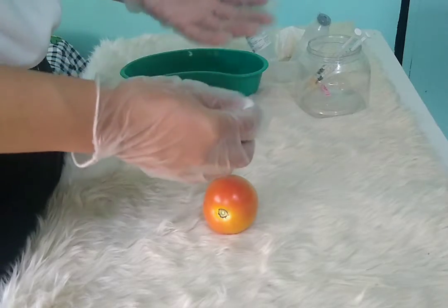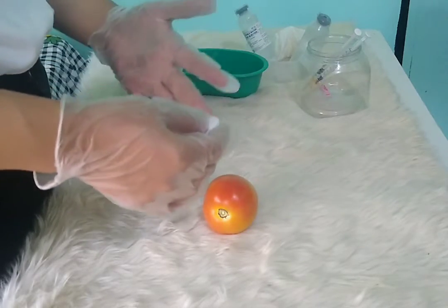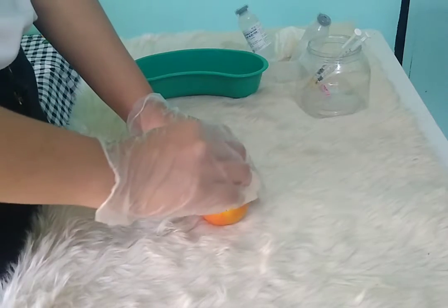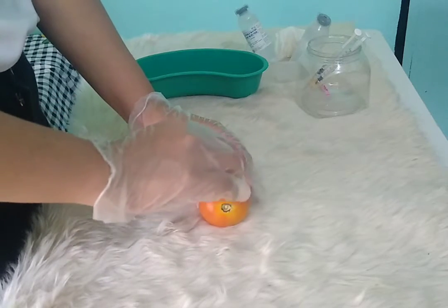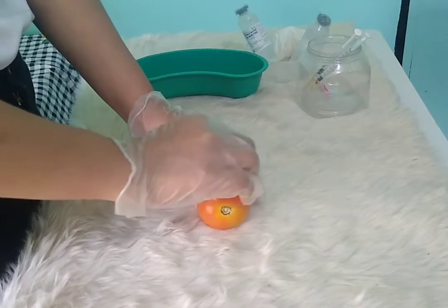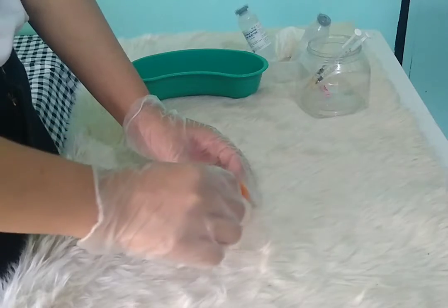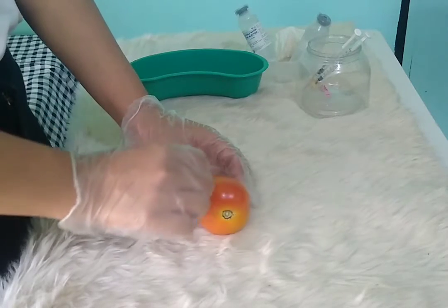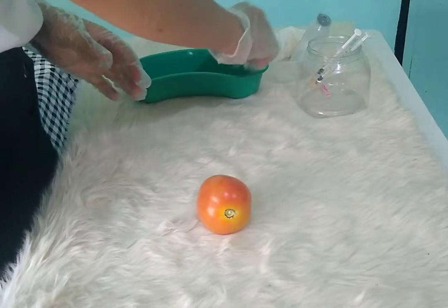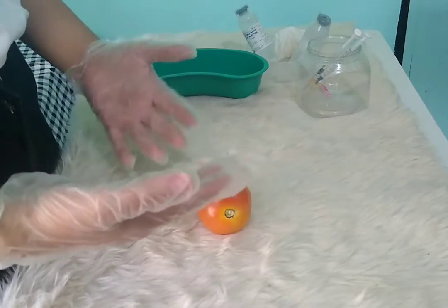Apply clean gloves. After we apply our clean gloves, cleanse the skin at the site using a firm circular motion, starting at the center and widening the circle outward. And then allow the area to dry thoroughly.